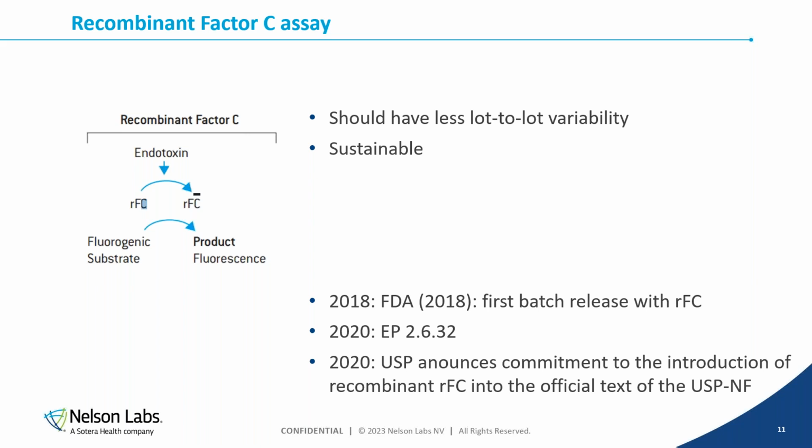It can be dependent on from which organism it came. So it's a well-known fact when using LALs that you have a lot of variability between different batches.